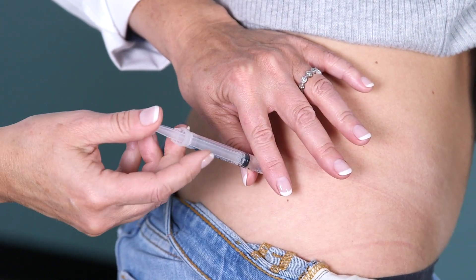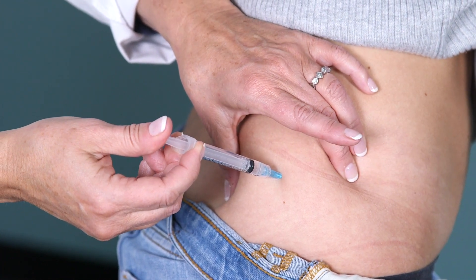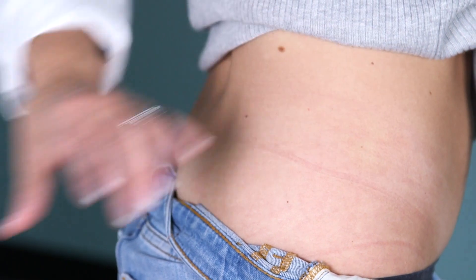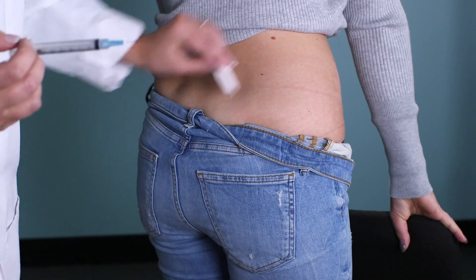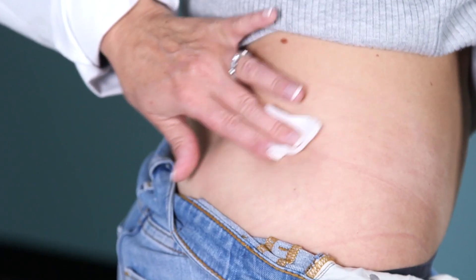Gently pull back on the plunger to check for any blood return, and gently press. Pull the needle straight out, and have an alcohol wipe handy if any blood is seen.